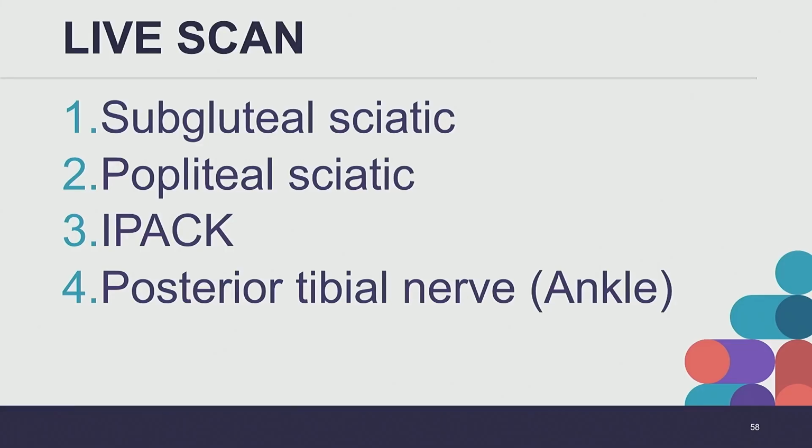Questions about that? Great motor sparing technique. Yes? With the lateral approach, what about the common peroneal? Yeah, and you should always find that too. That's a great point. So the question was, with doing a lateral approach, should we be looking for that sciatic nerve? Yeah. So just so that you know what to avoid.